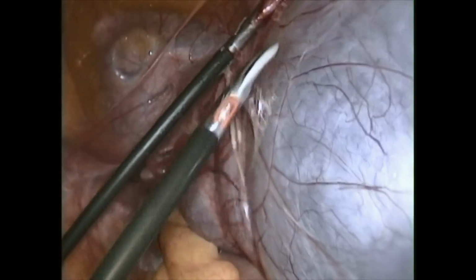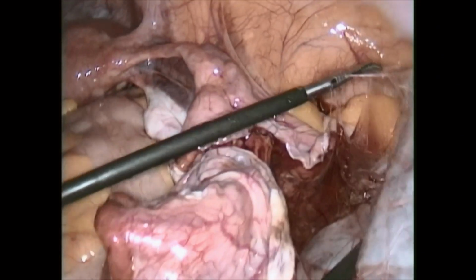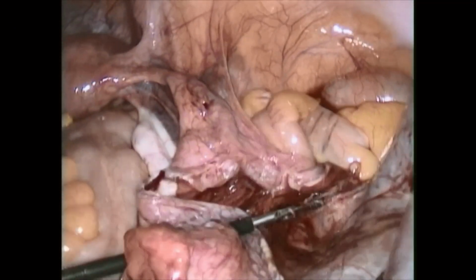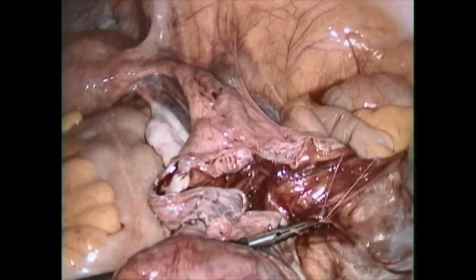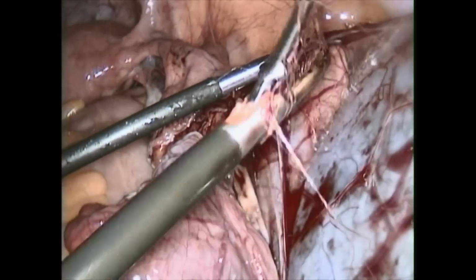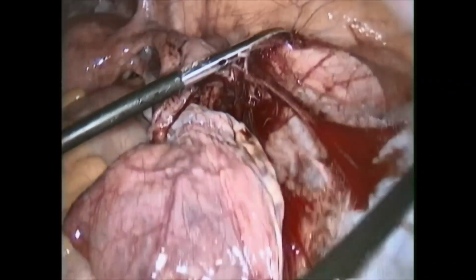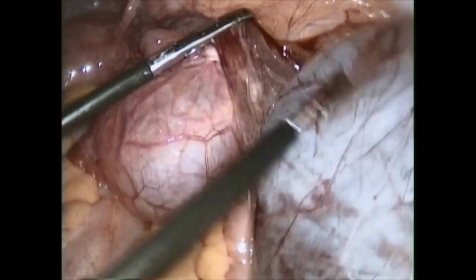You can appreciate here once I dissect it more. Now see this, it is totally separate from the ovary. By just blunt dissection you can achieve that.